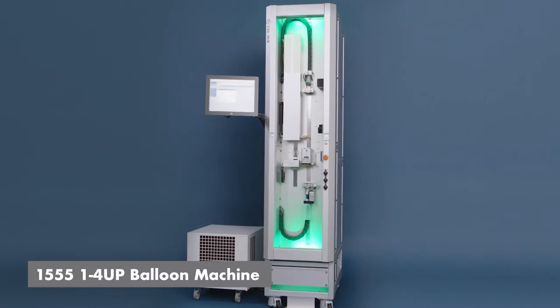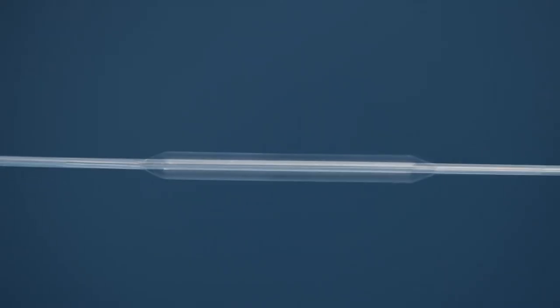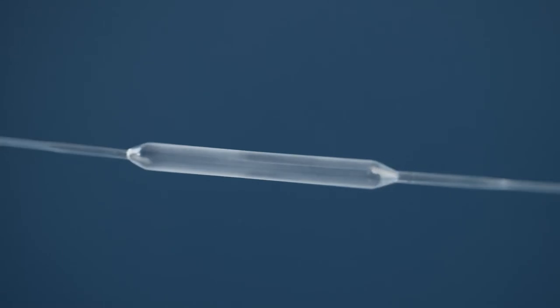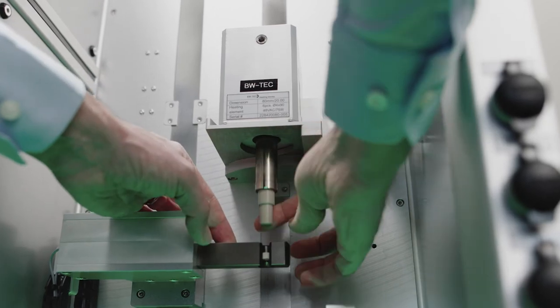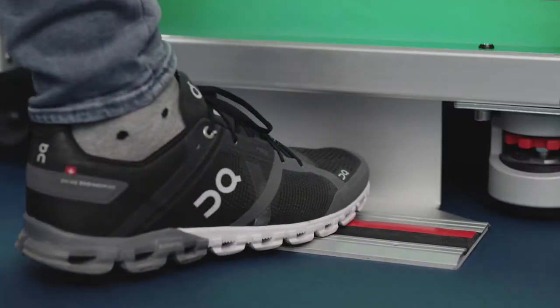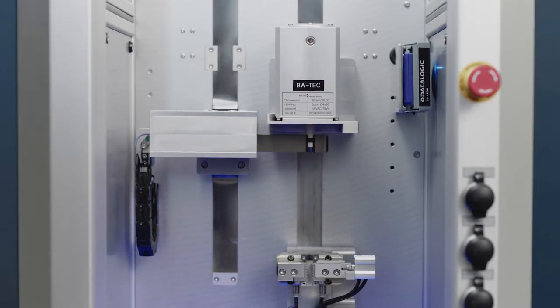The 1555 vertical balloon forming machine is designed to produce a wide range of polymer balloons for angioplasty and other medical applications. The electrically heated stretch blow molding process enables the production of very accurate and repeatable high-quality balloons with tight tolerances in an extensive variety of sizes and shapes.